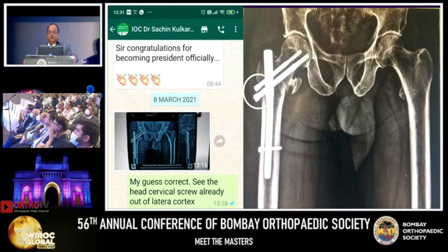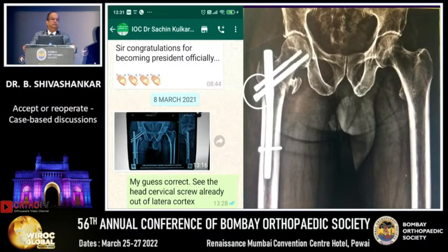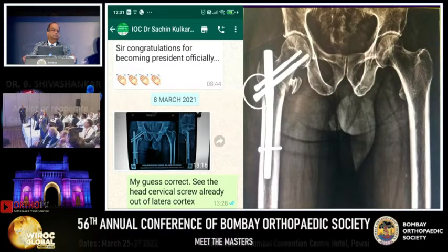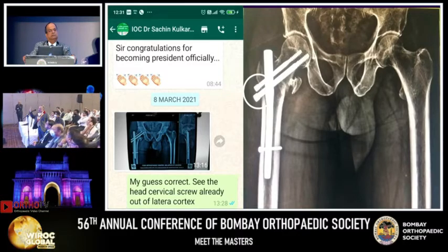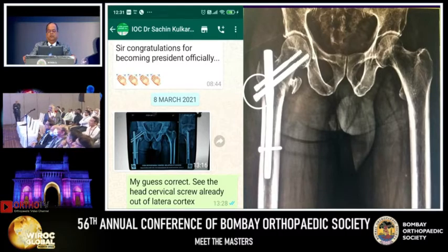Once I see the post-operative X-ray, let's discuss. He sent the pictures on 8th March — you can see the screw is already partly out. Too long. The distal screw has to be flush with the bone so as to create compression at the fracture site. If it is not abutting against the bone it will not compress the fracture site. The proximal screw is only anti-rotation, so even if it is a little out I don't mind, but the distal screw must abut against the bone.